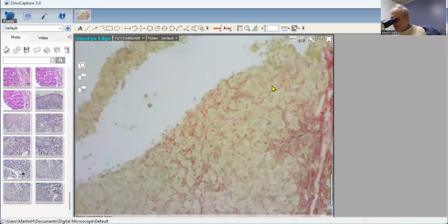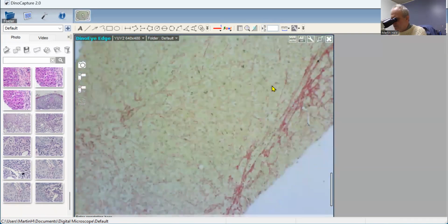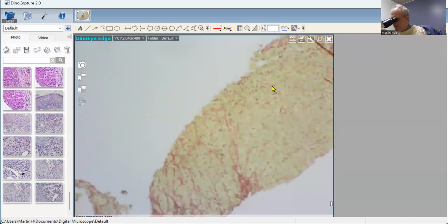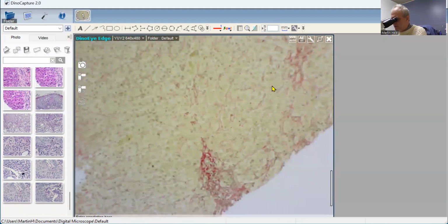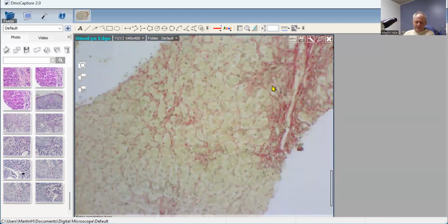So the telephone goes. History, very important. Communication with the physicians and anyone who's sending in the biopsy to try and glean additional information. So I suggested to Bilal, or I asked him, I think that there certainly could be an autoimmune component to this. It would fit with the serology. But as I said to him, the neutrophils, we've got to find a reason for the neutrophils. Is this alcohol or is it drugs? So Bilal, do you want to let us know what you found?